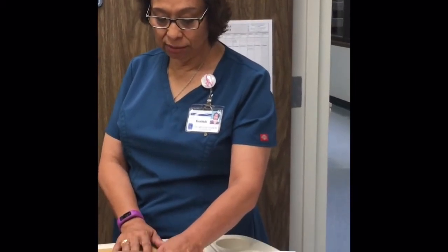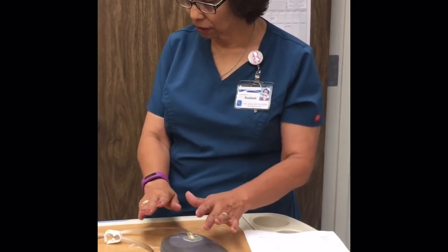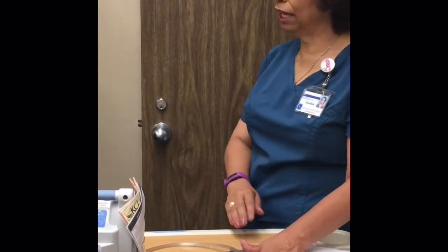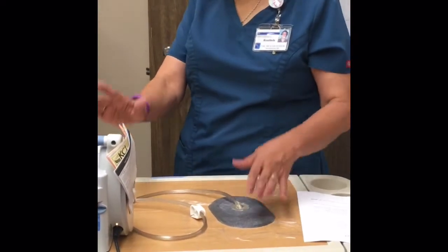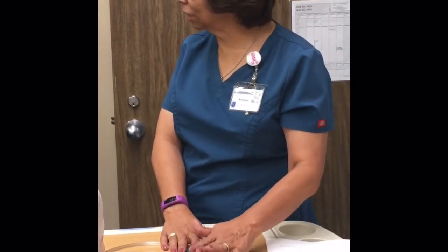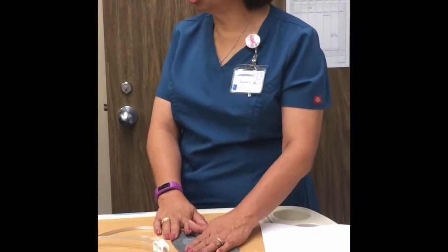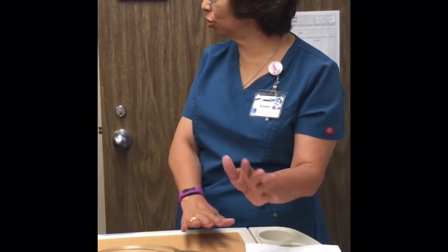So then you will put your drape down, reconnect, and the sponge will collapse, and you'll have your dressing done. Let's say that that doesn't work and you can't find the leak and you've been at it. Then you just leave the unit on, leave it as such, go find some help, because the last thing that anybody wants to do is put multiple layers of drape. It will never work. You'll never find it. So it's better to get someone to help you start the whole process over and just do the whole dressing again.